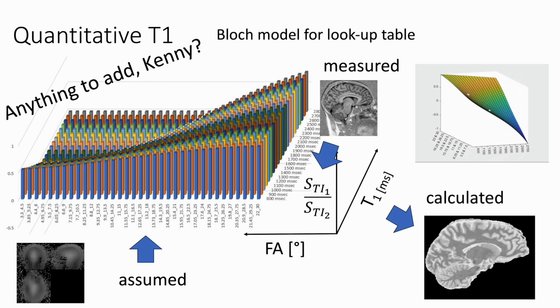So the second thing I want to show is that if you look at the bar graph at the left upper end, you can see the area seems flat. So basically, that is the zero. The ratio is 0 over there. So that is the flat. What it means is all the bars over there are going downwards, the negative value over there. So this is the one I really want to point out.